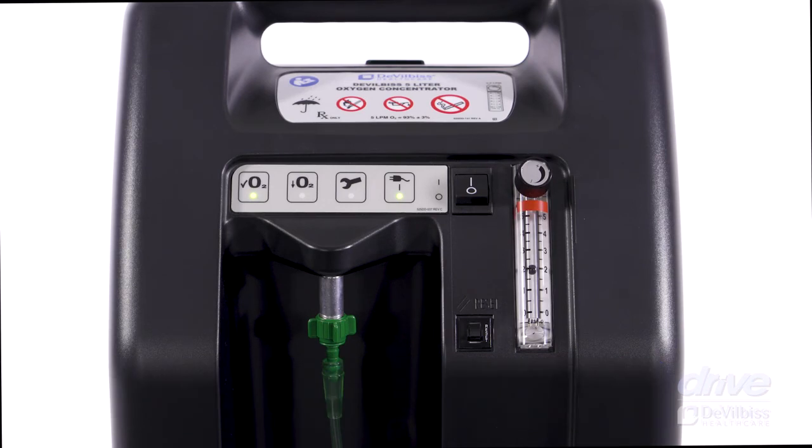Properly position your cannula or mask. If your oxygen concentrator sounds a visual or visual and audible alarm for low oxygen purity, switch to your backup system and contact your equipment provider.